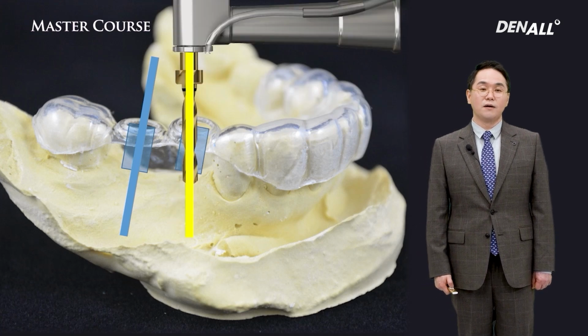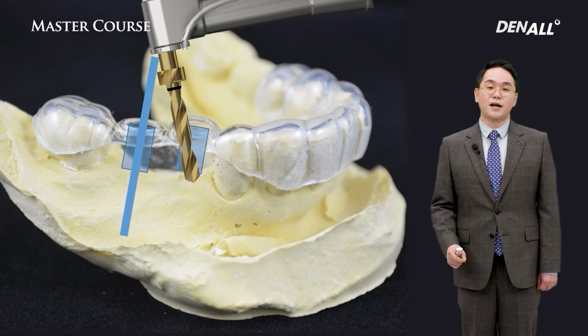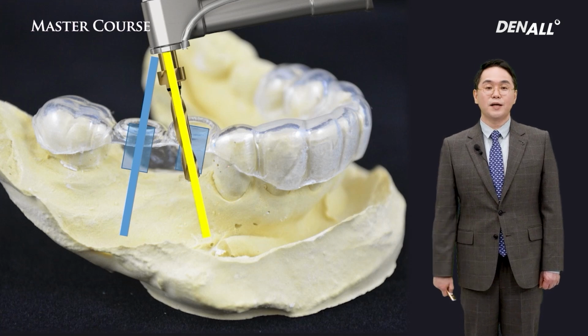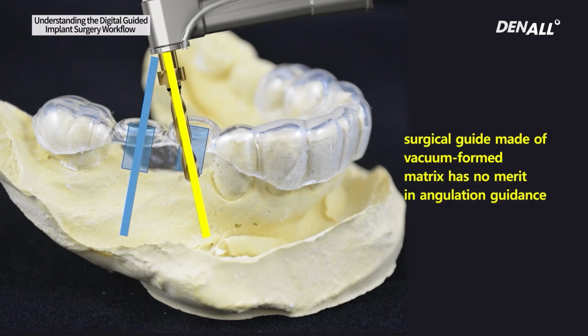When a patient cannot open the mouth widely, the drill can go in a different direction. For full depth drilling, the handpiece can easily go distally. Like this, it can damage the root of an adjacent tooth despite using a surgical template. So among the surgical guides, the vacuum formed matrix, the analog style surgical guide, doesn't help in controlling the angulation.